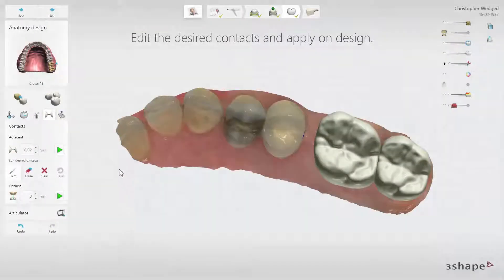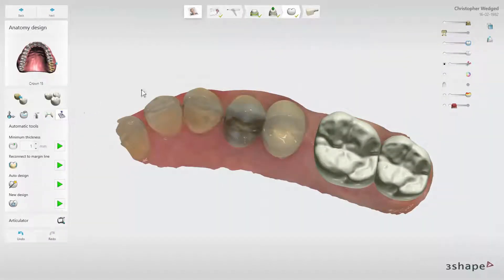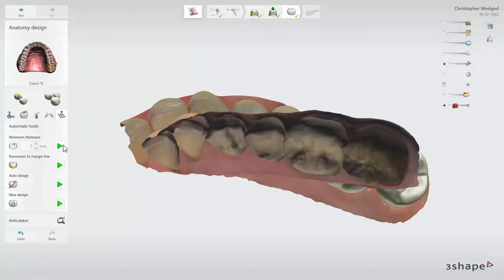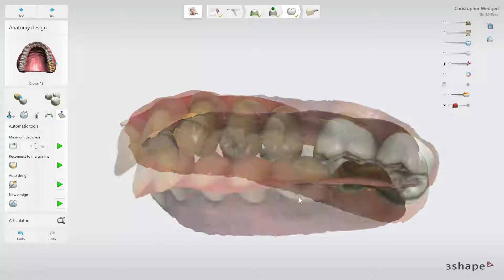At the end, go to the Automatic tools. Here you can activate the Minimum Thickness map. The red area that may appear will show where Minimum Thickness is violated. You can enforce Minimum Thickness to meet the material requirements by clicking the Minimum Thickness play button. After enforcing the Minimum Thickness, always check how it may have affected the design.